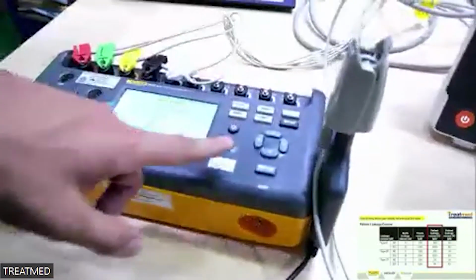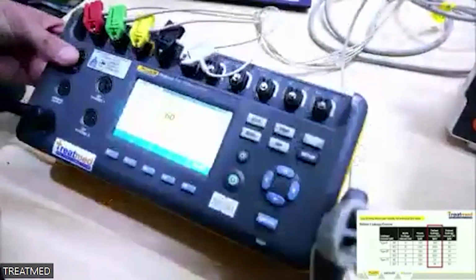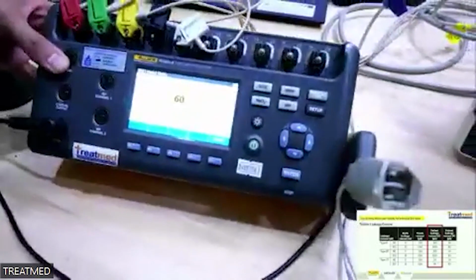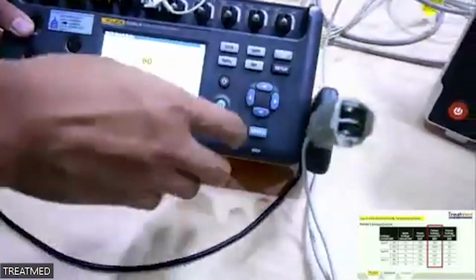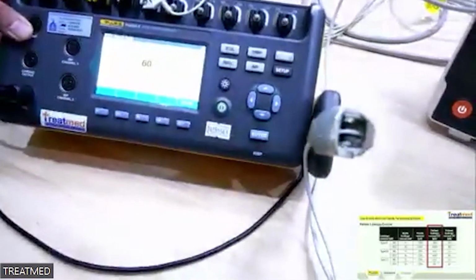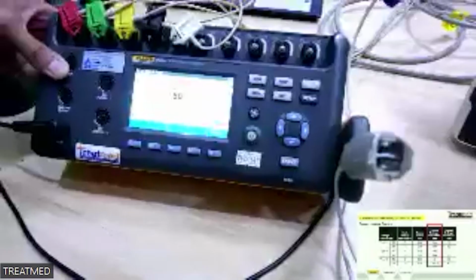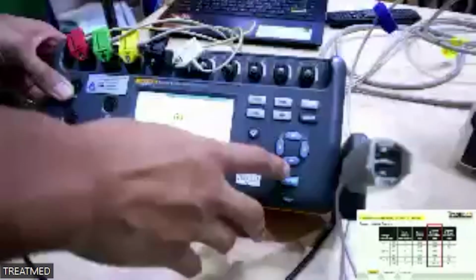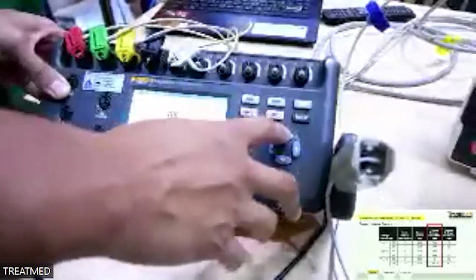And then set the heart rate. Normally in Thailand, we set the heart rate depending on the end user. For a normal patient monitor, we use 60, 80, 100, and 120, something like that. And in this case, we will set 80 BPM.